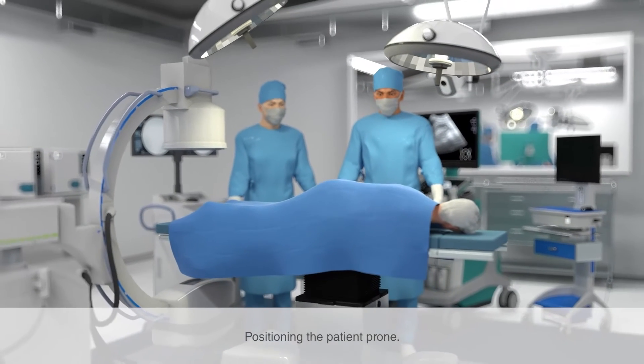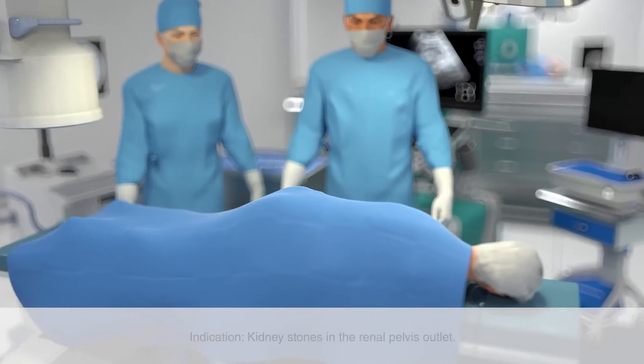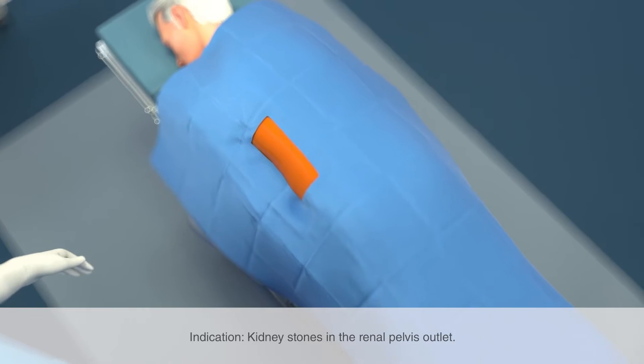Position the patient in the prone position. Give the patient a sedative and perform the procedure under local anesthesia. This patient has kidney stones in the renal pelvis outlet.